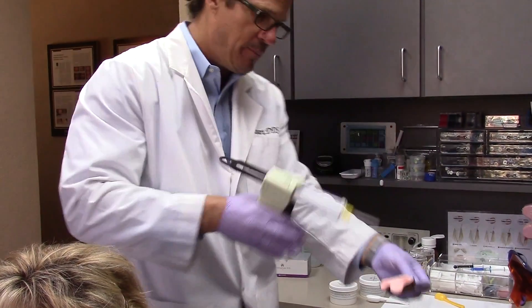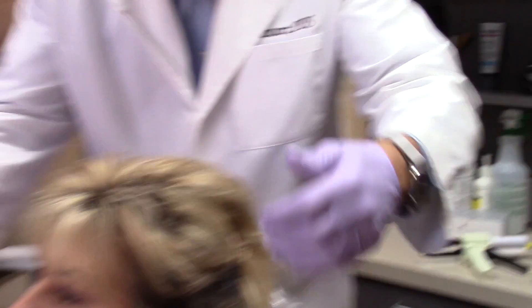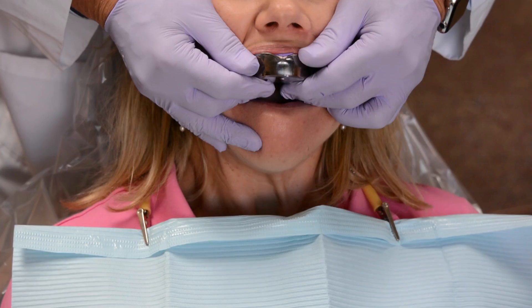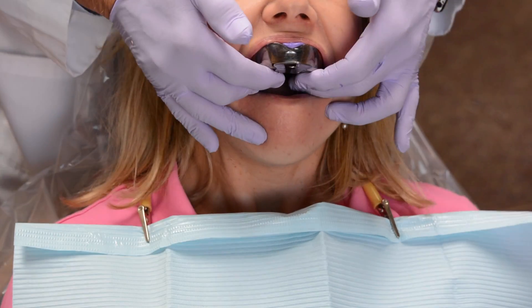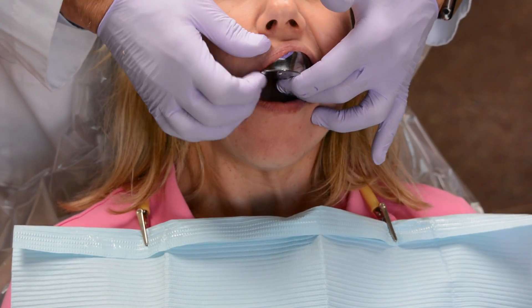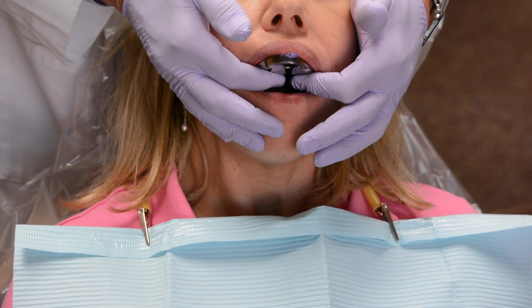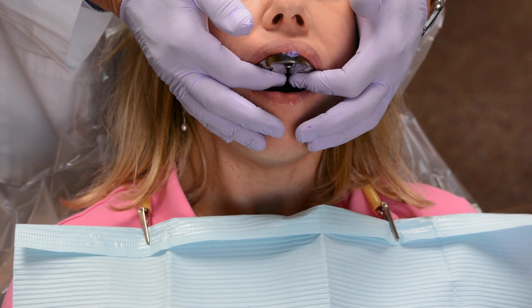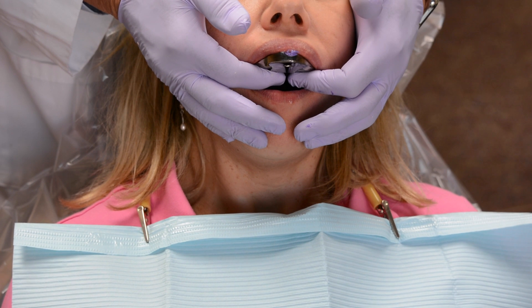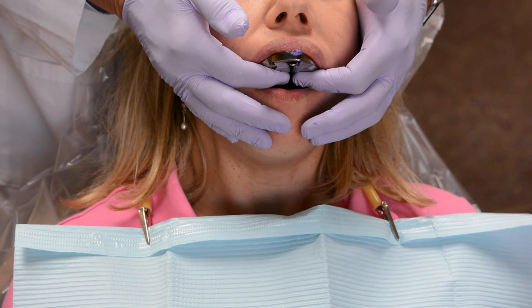Just a little bead of wash is all we need. We go back into the patient's mouth, seat it back in up to the point where we stopped, then go a little bit more and we can see that wash oozing out. Now we're just going to let this sit for four minutes. The key is putting not too much wash in there so you don't get any running down the back of the throat.